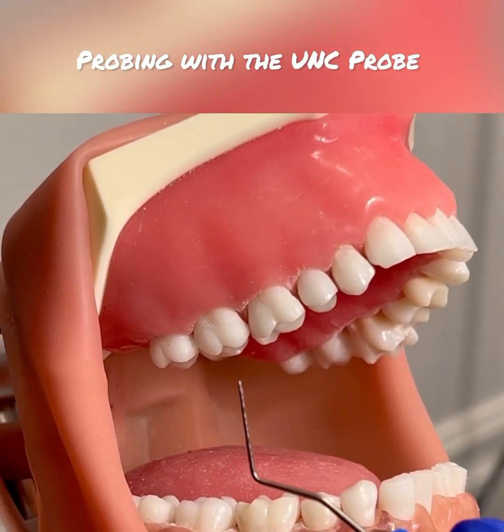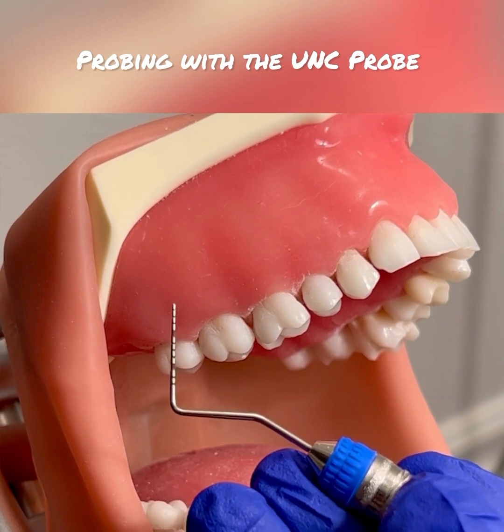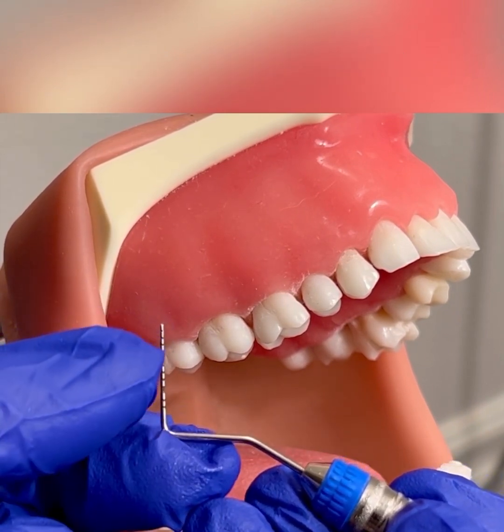In this video I am going to demonstrate probing with the UNC probe. The UNC probe has one millimeter markings.